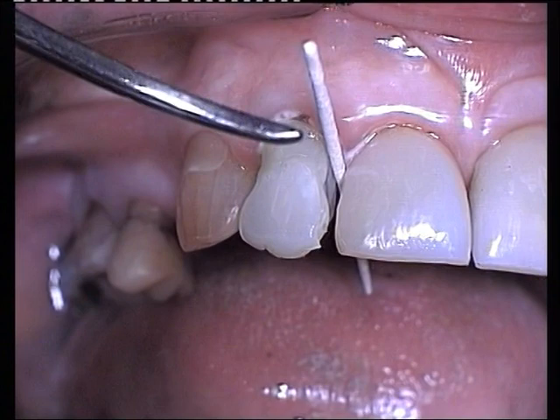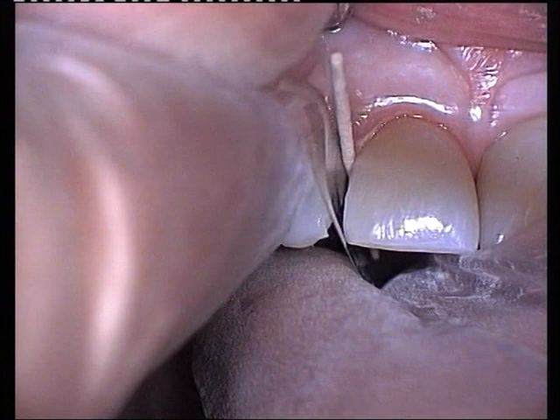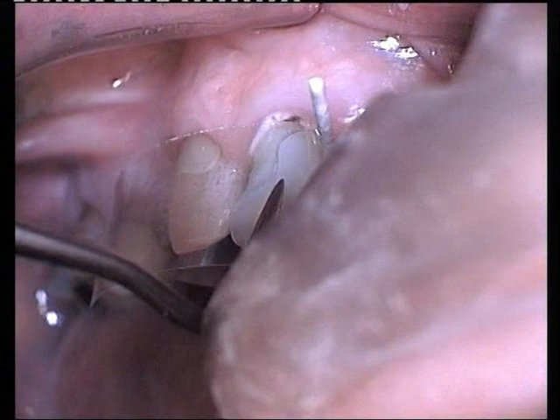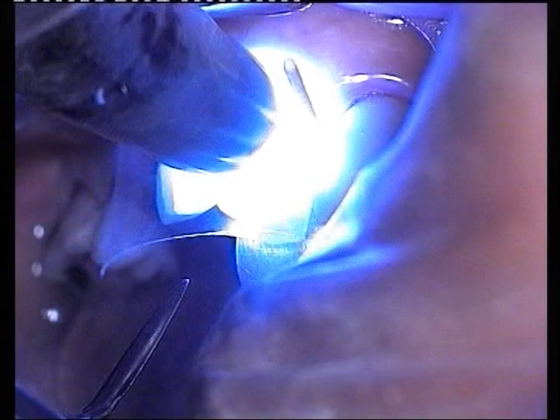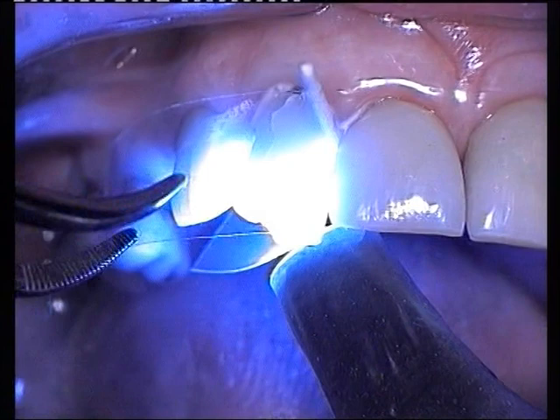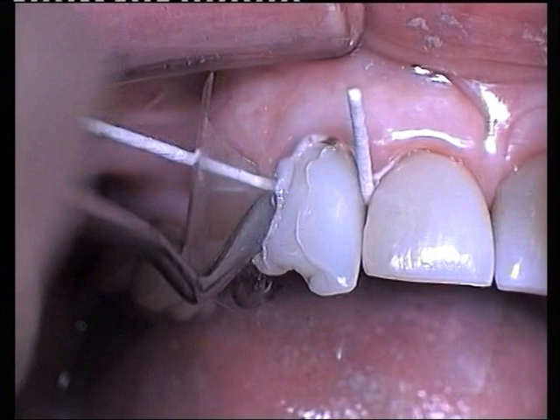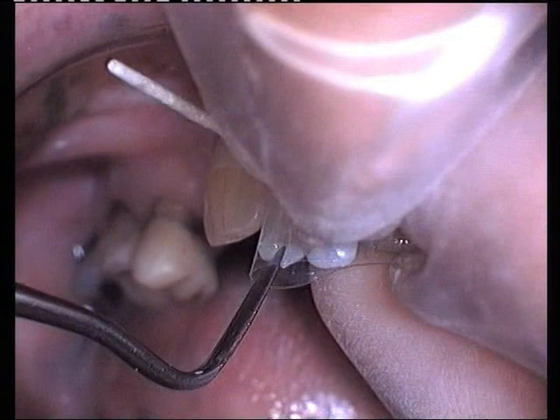A paper point is gently wedged interproximately between the crown and the adjacent tooth, and a mylar strip inserted into the proximal space. A small amount of bond is applied with a micro-brush, followed by an increment of micro-fill incisal shade into the proximal area. The mylar strip is wrapped around the crown and the preparation spot-cured for 5 seconds on both labial and lingual surfaces. The procedure is repeated on the adjacent surface. Paper points prevent overhangs and also absorb proximal exudates.